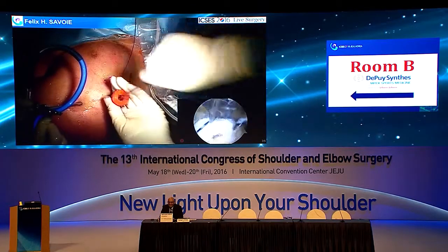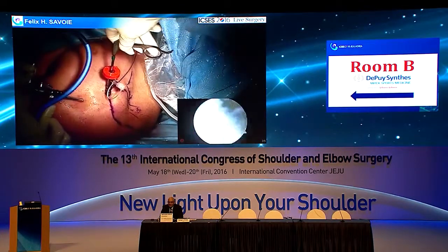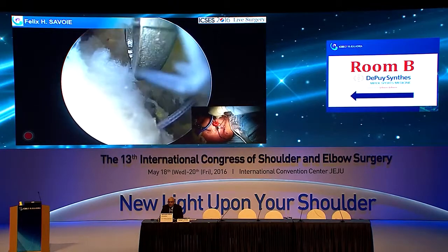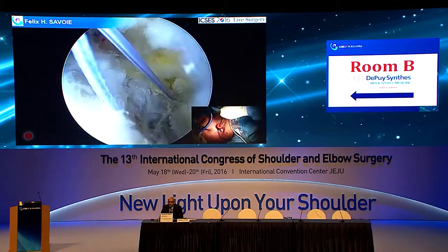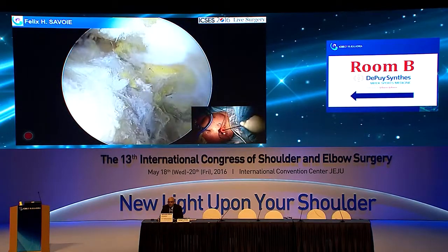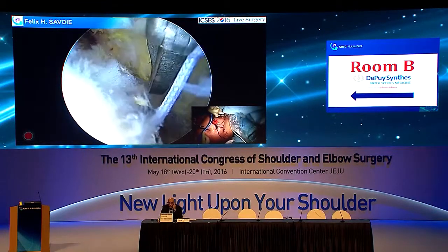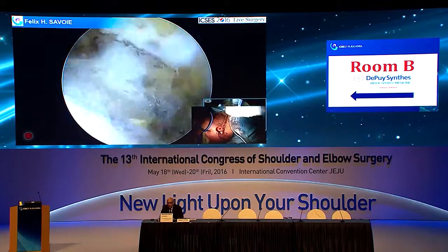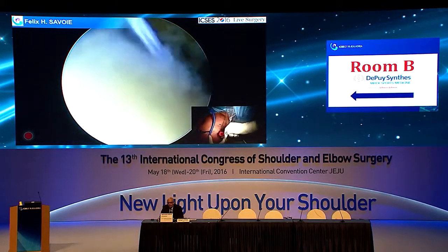So, all right, so let's see what we have here. So here's our one and second one here. That's the back one, and the front one, I think, is right over here. Now, is there a reason why you chose to cut one stitch? Because I believe this lateral row anchor can actually hold up to 4 sutures. It can hold 4. So, yeah, so I'm going to put 3 in it.